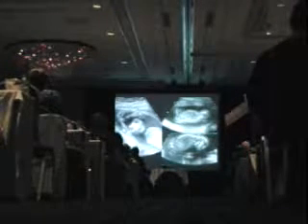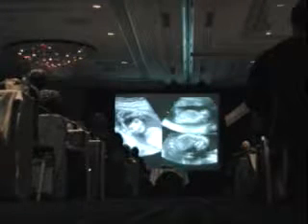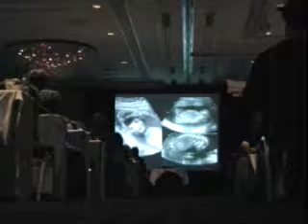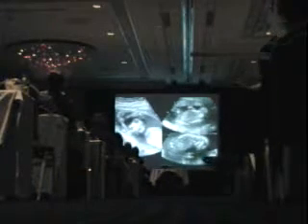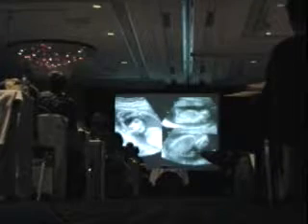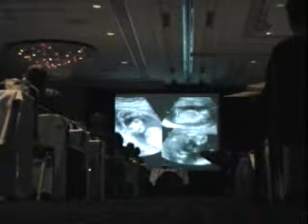I think it's probably having just intractable seizures. And not only will it look frog-like, and this is the classic look to it, and sometimes you see echogenic fluid because of the autolyzed brain that is in there. But if you look at the movement that takes place, it's sort of these jerky type of seizure-like activity, which is very common, and these fetuses move more than other fetuses.